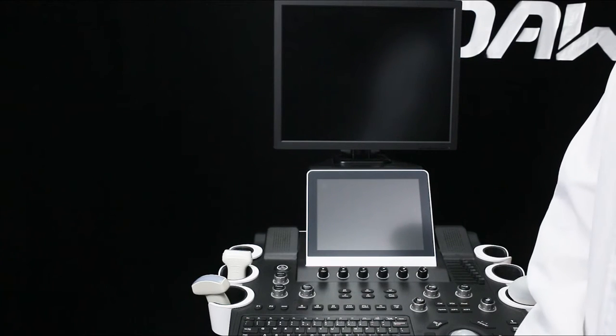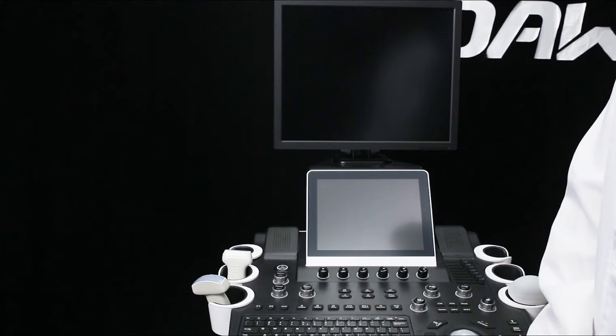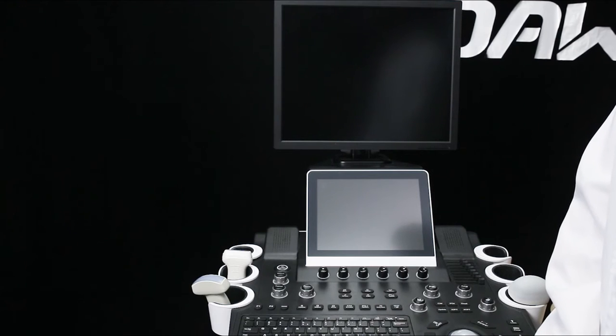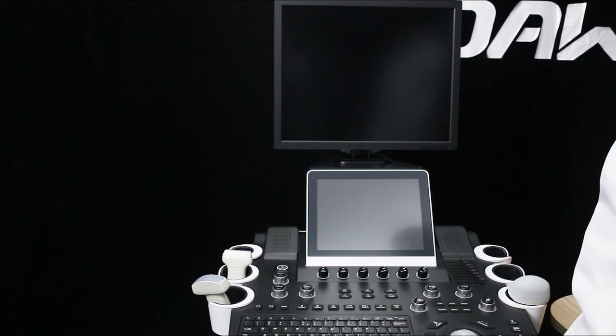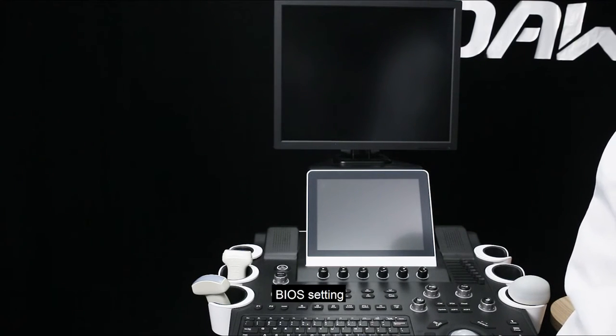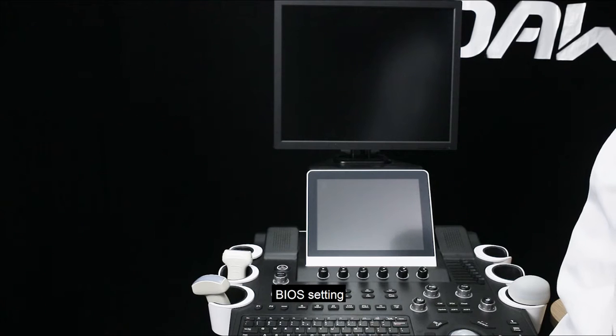System recovery and backup, the function of USB disk, backup, BIOS setting.